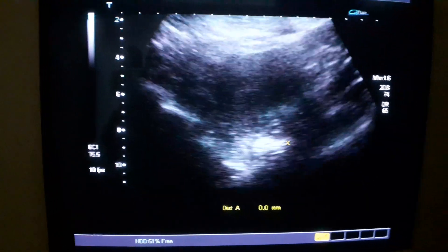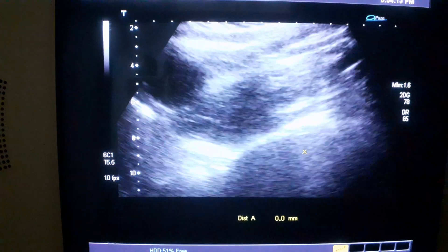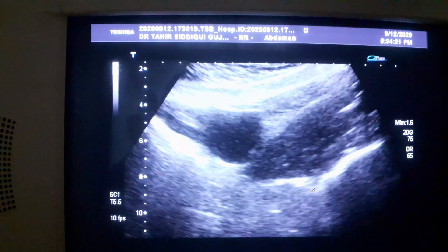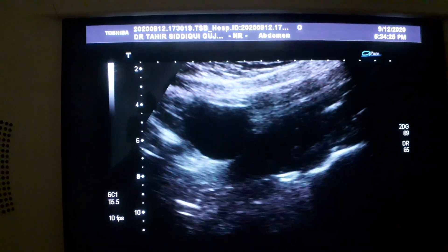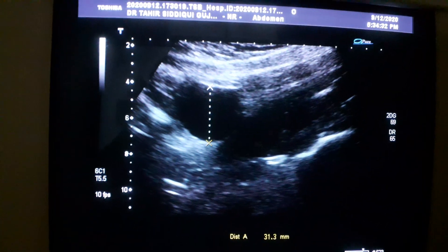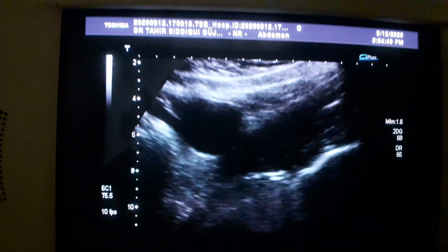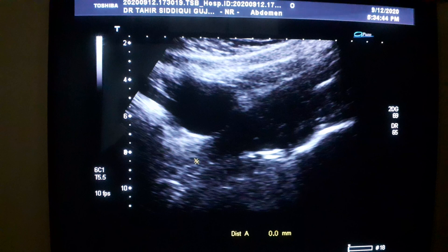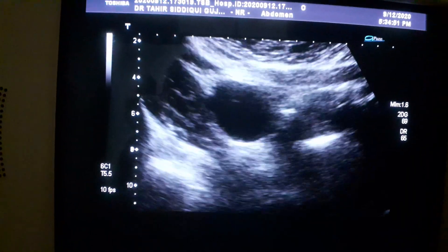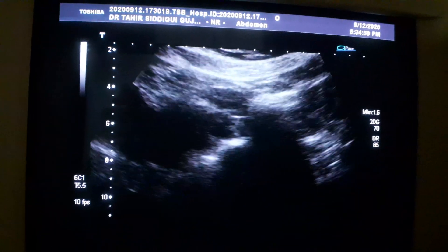I want to show you that there is a cystic area here. This cyst measures approximately 32 x 32mm, is rounded, and you can see posterior wall enhancement. Giving a sweep to the probe of 180 degrees does not change its shape. It has a thin wall.